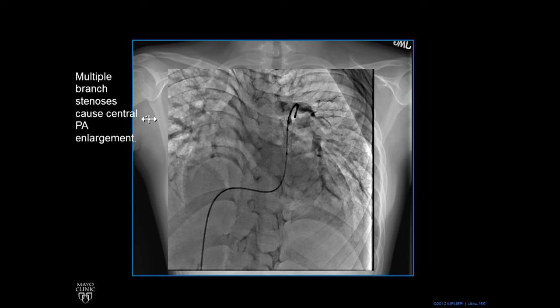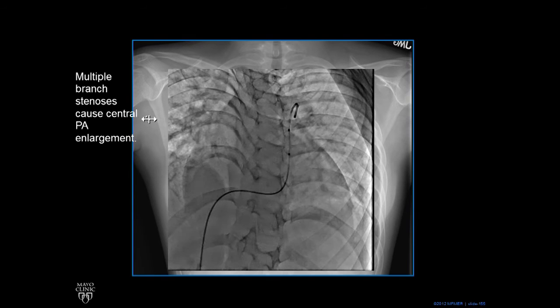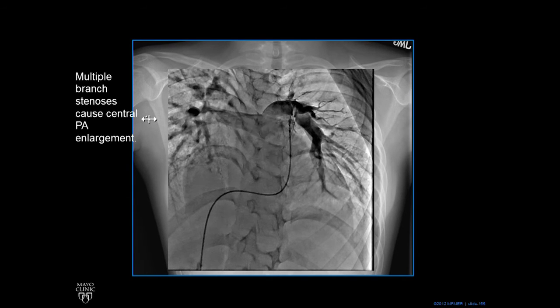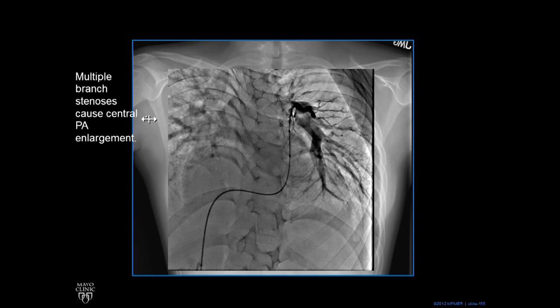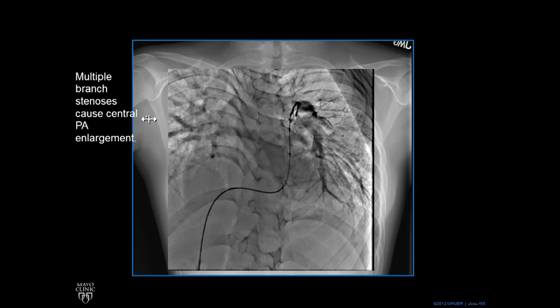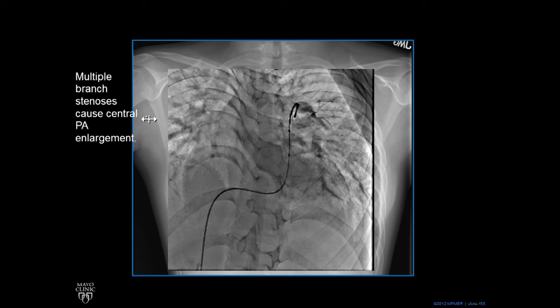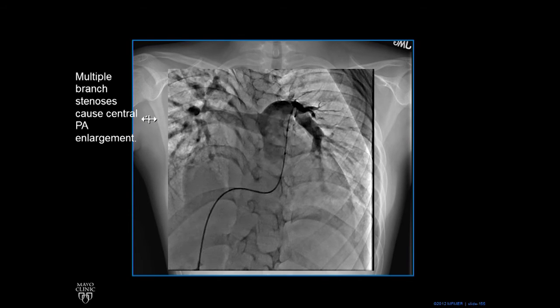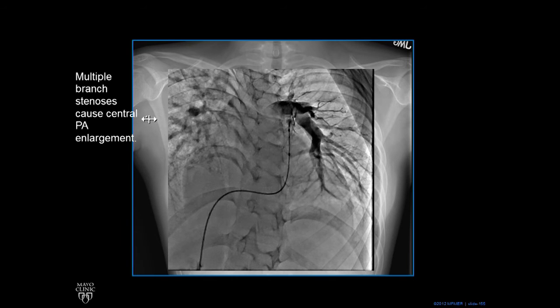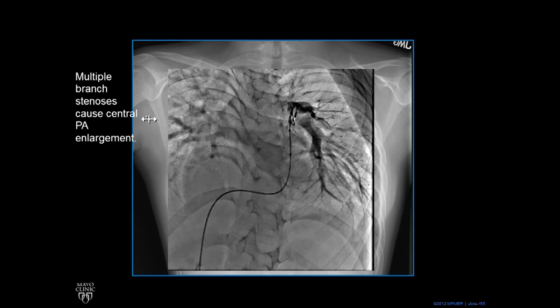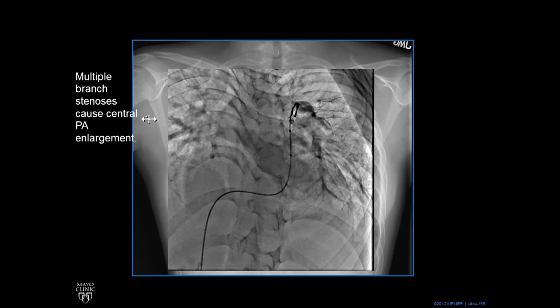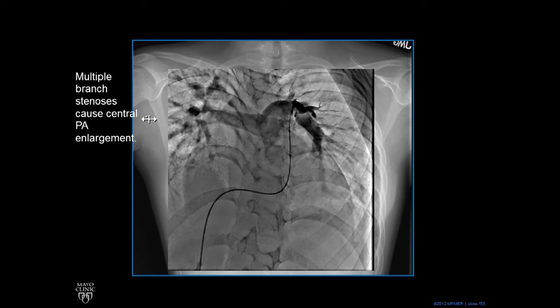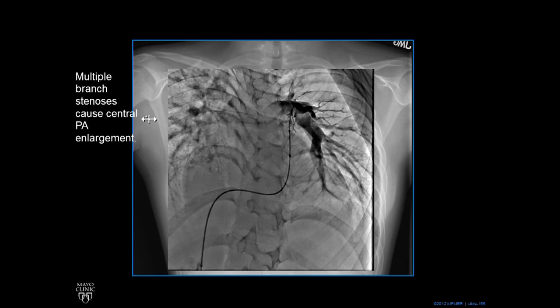Here's an angiogram. This catheter is in the left pulmonary artery — it's supposed to be injected into the left vessels and they're supposed to fill up nicely. You can see the right pulmonary artery goes out, and a lot of these vessels get very narrow. The right side — the patient's right — there are a lot of narrowings. They're harder to see on the left; these left vessels don't look as bad. There's less perfusion in the left lung because their left pulmonary vein was obstructed.